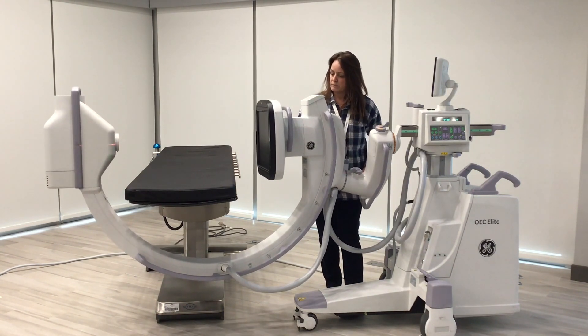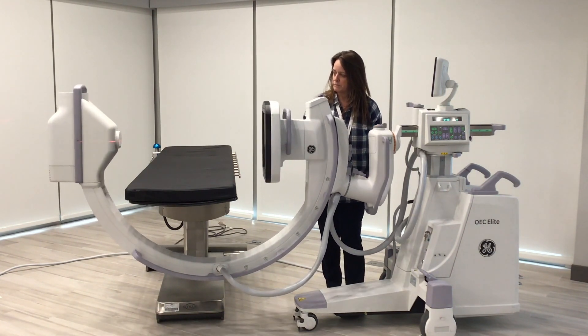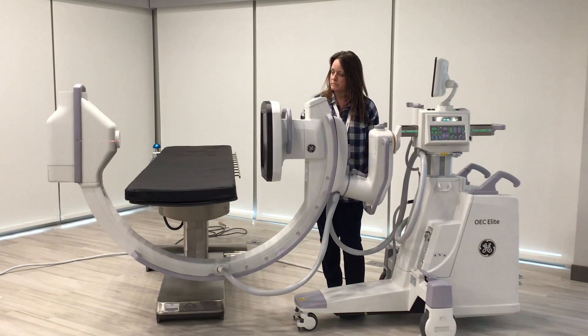You see Rebecca is able to turn the C-arm in several different directions at one time. A lot of times this just helps in positioning, getting those circles perfect without having to do individual locks.